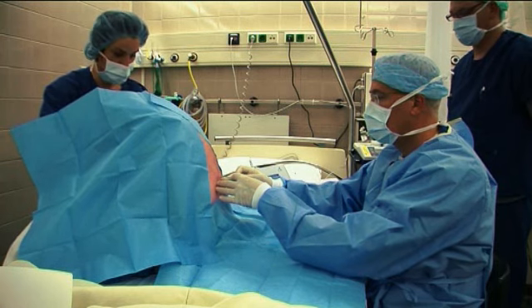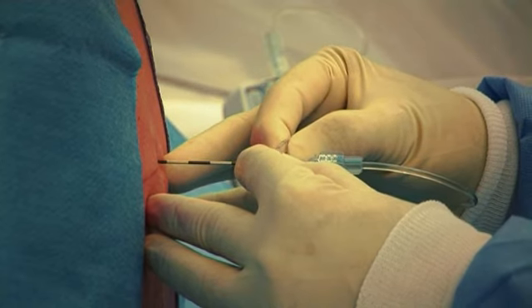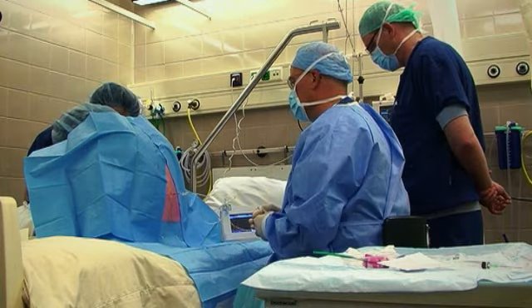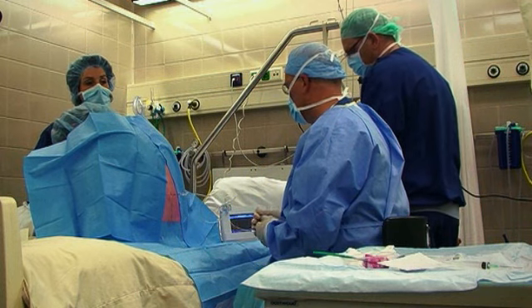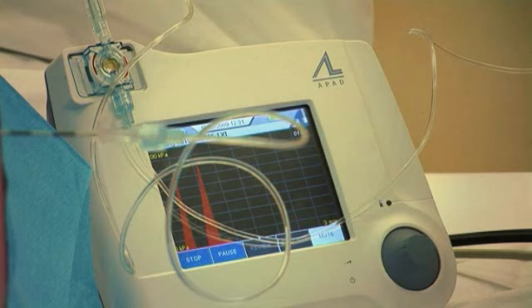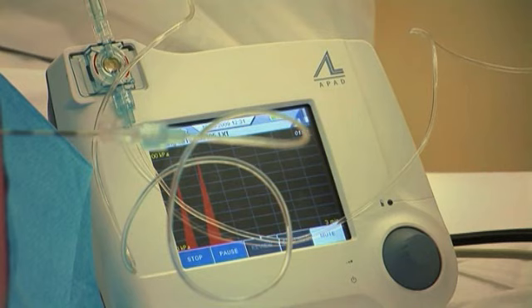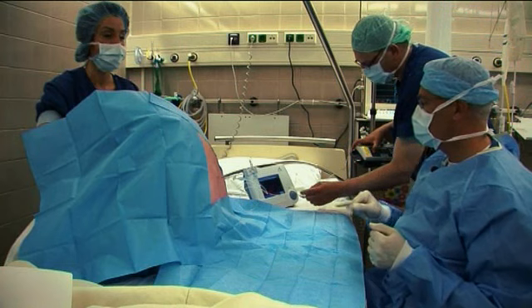When the ligamentum flavum is reached, the pressure increases even further. The pressure suddenly drops when the epidural space is reached. At that moment, the anaesthetist stops inserting the needle immediately. If the pump is still running and the pressure doesn't rise again, it's certain the needle tip has reached the epidural space. The graphic representation of the puncture gives absolute confirmation that the epidural space has been reached and can be used to document the puncture procedure.